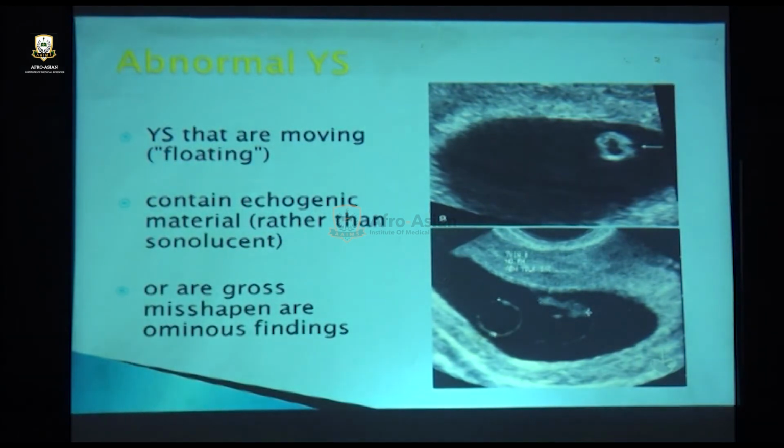इसी तरह yolk sac की जब बारी आती है तो look at the yolk sac. If it is 4 millimeters, it is normal. If it is more than 6 millimeters, तो ये abnormal है. या तो sustain नहीं करेगी pregnancy या उसमें chromosomal abnormalities होंगी. और इसकी wall देखें, it is thick and sometimes the sonolucent part of the yolk sac is also white. ये सारे का सारा white होता है. These are all abnormal indications.